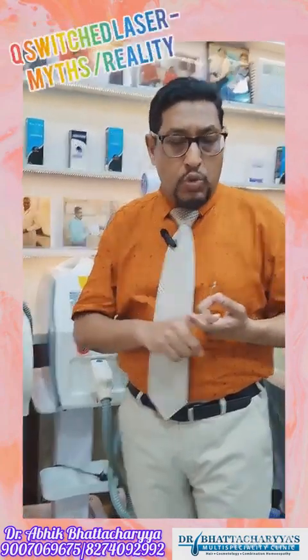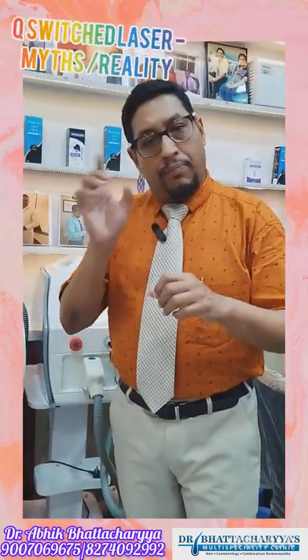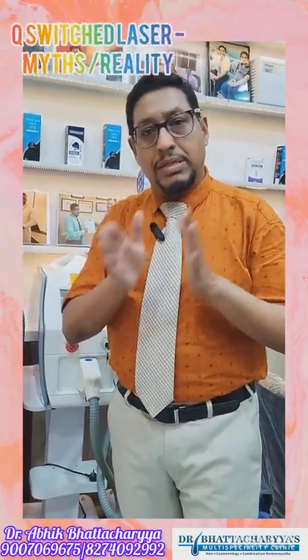So these are all complications. The last thing, which should always be kept in mind, is scarring. Scarring is a very bad outcome of laser treatment. Always do it in proper proportion, with proper fluence, and all procedures should be done by a properly trained person who has the experience to handle many patients like this.